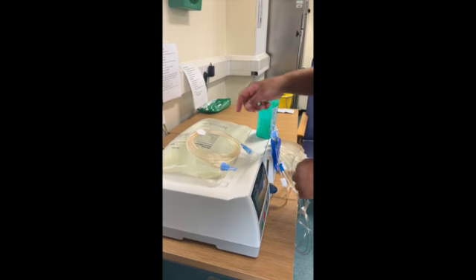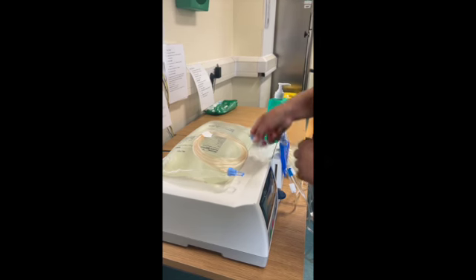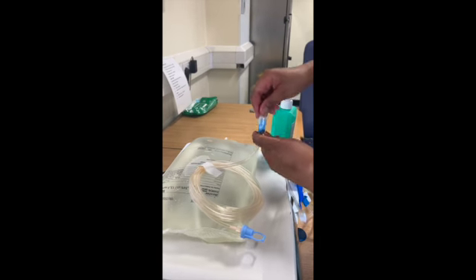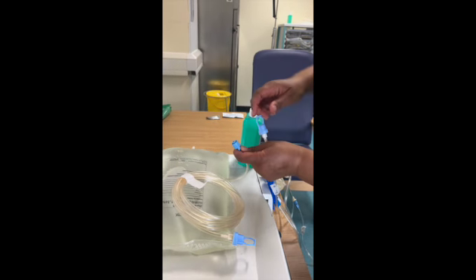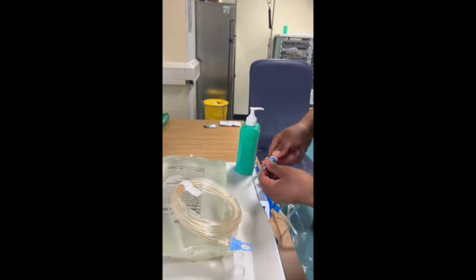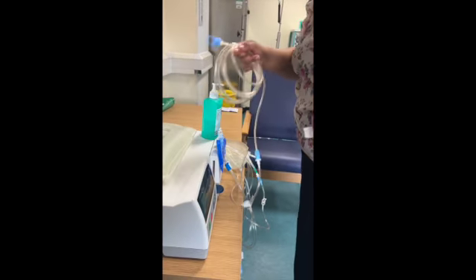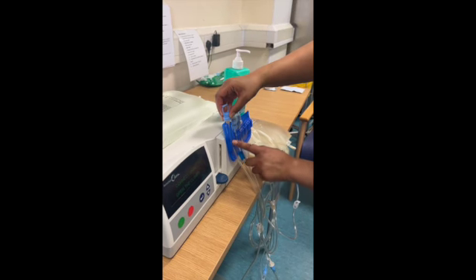I'm now going to connect the extension line to the patient line to form a new patient line. And again, being very careful not to touch what's on the inside, just to make sure that I don't put myself at risk for infection. I now put the line back into the blue organiser, making sure that this is all the way down.